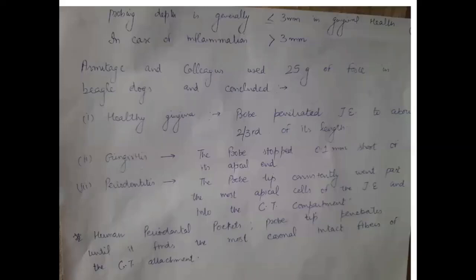The reason is very simple. When the gingiva is healthy, connective tissue is more fibrous, and the fibers of the connective tissue resist the penetration of the probe.